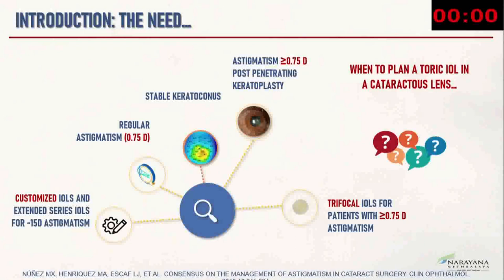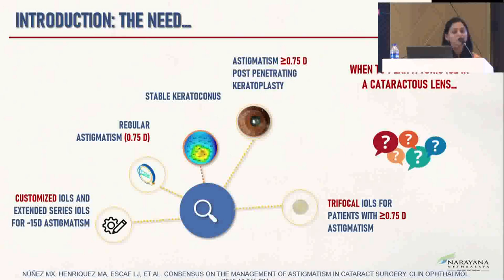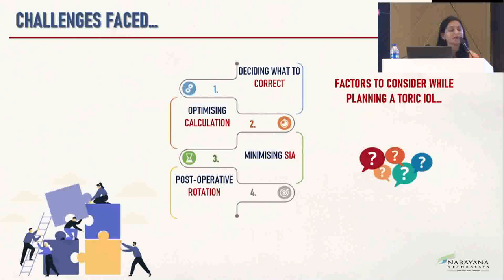So when do we implant toric? When do we plan? In case of stable keratoconus, when there's regular astigmatism starting from plus or minus 0.75. You can even customize your astigmatic IOLs up to 15 diopters. And even post-PK, or even when a patient is choosing a premium IOL, you would want to make sure that there is no residual error at all. So in these patients, it's always better to do a detailed evaluation and plan a trifocal toric IOL. So what are the challenges that we face? Mainly deciding what to correct, optimizing the calculation, making sure there is minimal surgically induced astigmatism, and making a note of post-operative rotation.